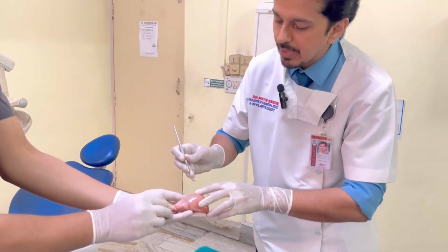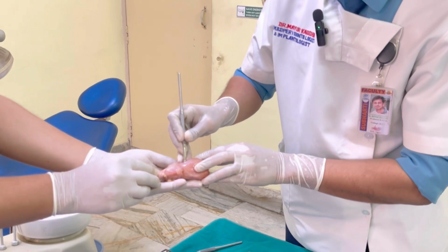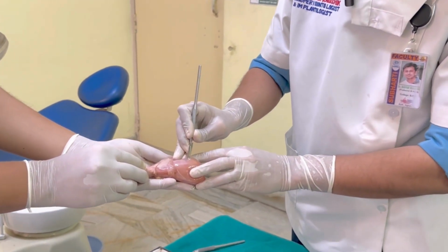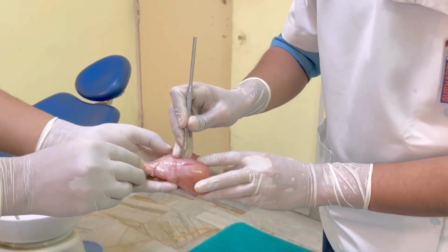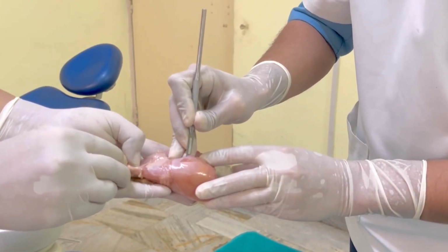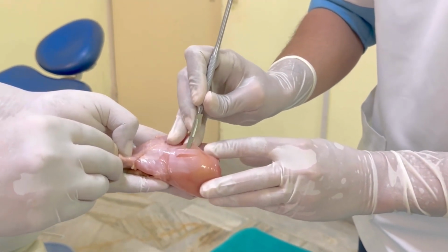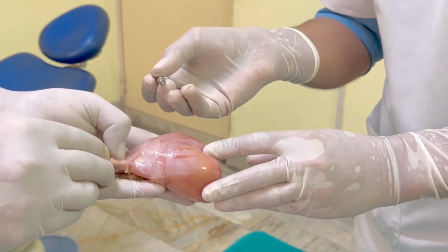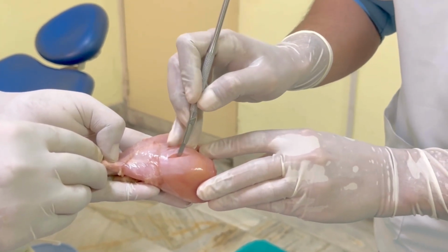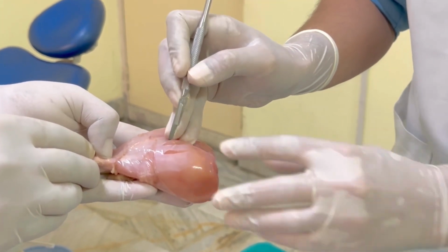Now once I have attached it, the basics of learning a good incision is the stab wound. I have to go till the base and then I have to move it like this. So again I will demonstrate. I have to achieve the desired depth with my first incision and then I have to move it forward, and this is how an incision is achieved. This is fast, this is quite economical, but the only issue is that oozing will occur in a patient's mouth whenever this incision is given.